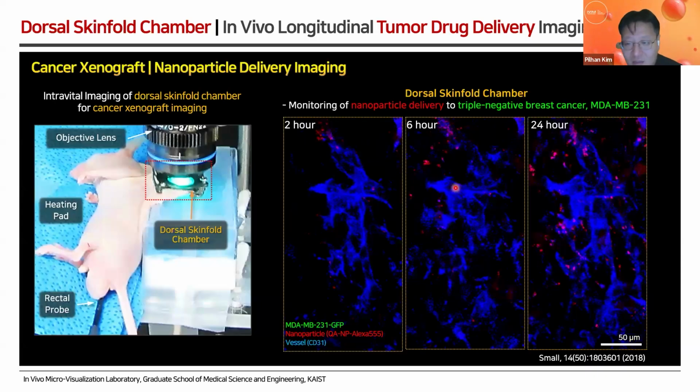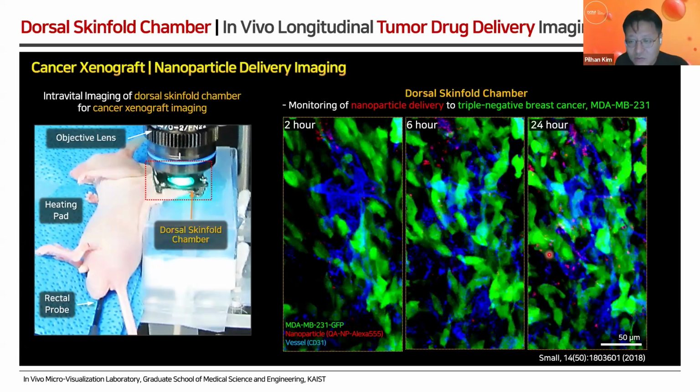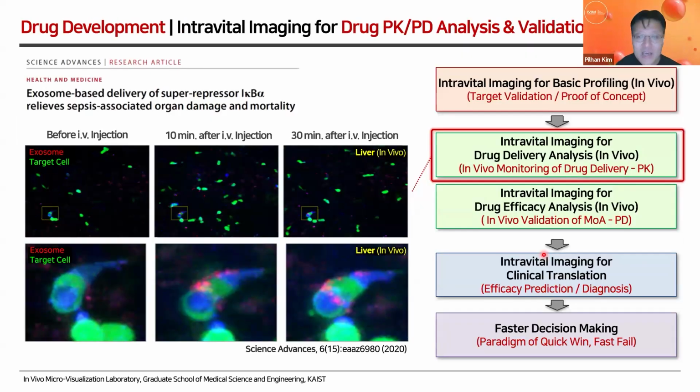Let me zoom in. But finally, at 24 hours, we can see that all of the nanoparticles get out from the vessel, right? 2 hours, 6 hours, 24 hours, and then finally, delivered to the tumor cells. Okay. So this is one very good example to monitor the drug delivery to the target tumor cell in these cases. We can also image other drugs.